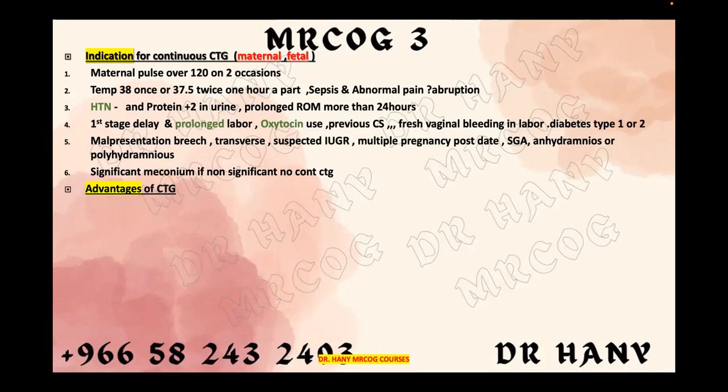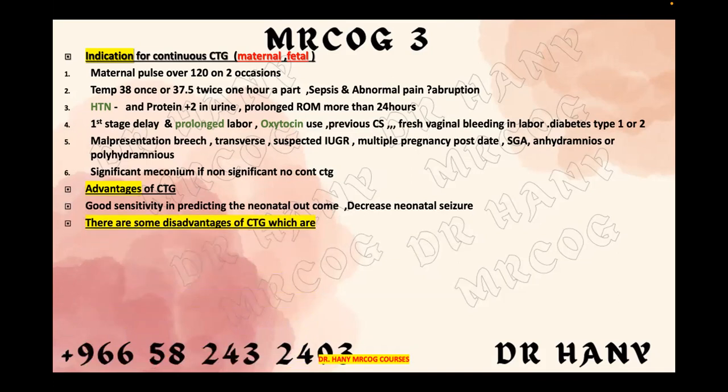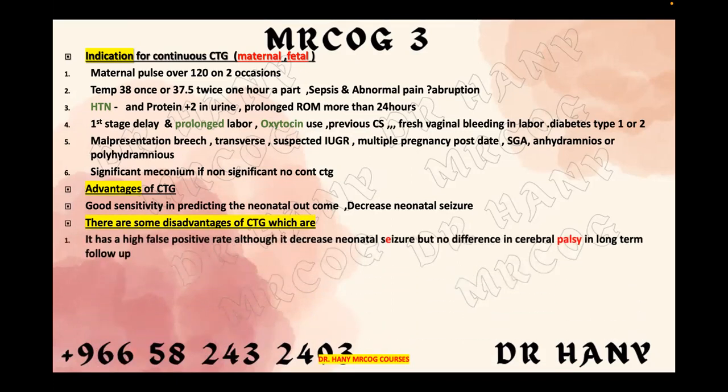What is the benefit from CTG? Actually, there is an advantage. It has a good sensitivity in predicting the neonatal outcome and decreases neonatal seizures. But there are disadvantages as well. The disadvantage is that you are focusing on the baby and the mother is out of your scope. It has a high false positive rate, and although it decreases neonatal seizures, there is no difference in cerebral palsy in the long term.